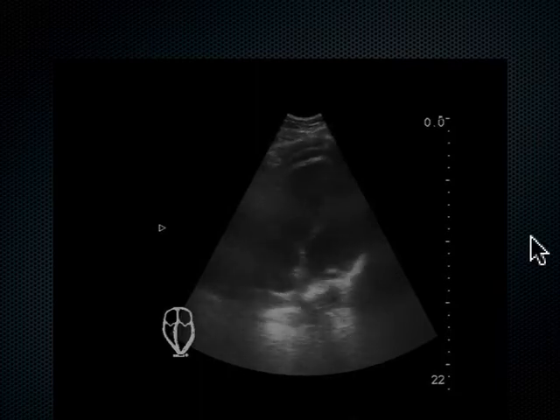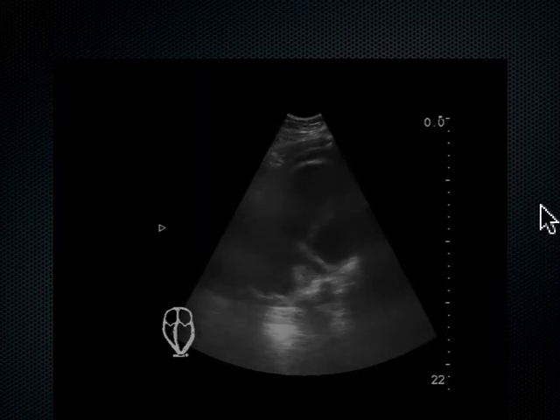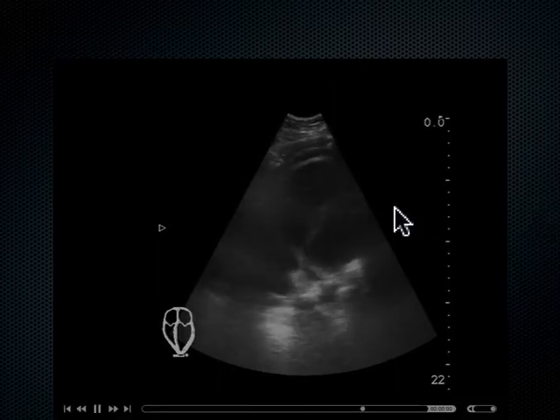Now, about 30% of the time, you don't feel a carotid pulse, but you actually see this amount of cardiac activity. So this is called PCM, pulseless cardiac motion. It tells me the patient's still alive, okay? I don't know why they're not having a carotid pulse. It's not enough blood pressure to make a carotid pulse, but about 30% of the time, you will see cardiac activity, yet no carotid pulse. I shouldn't say good cardiac activity. This is very weak cardiac activity.